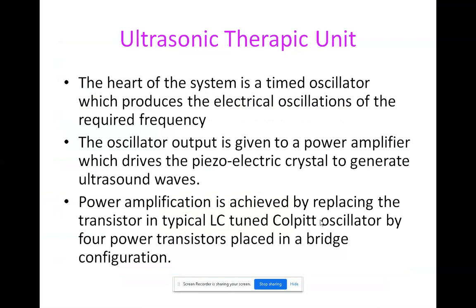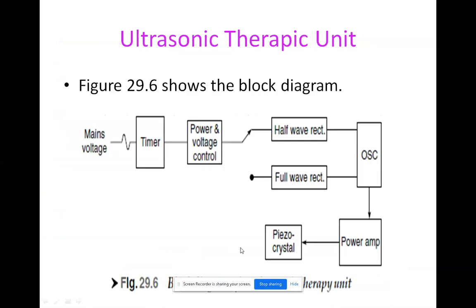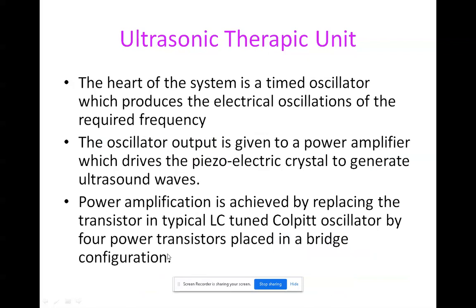A power amplifier will receive the oscillator output, which will drive the piezoelectric crystal to generate your ultrasound waves. Next, connected to the piezoelectric crystal, the power amplification is achieved by replacing the transistor in a typical LC tuned Colpitts oscillator by four power transistors placed in a bridge configuration.